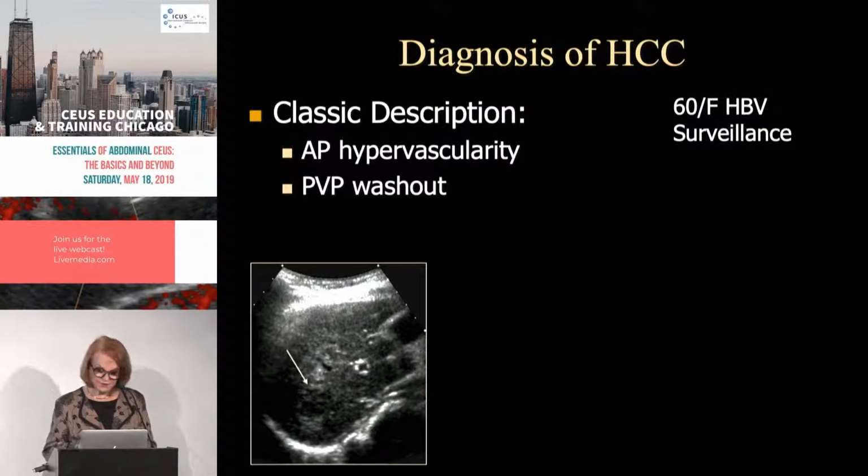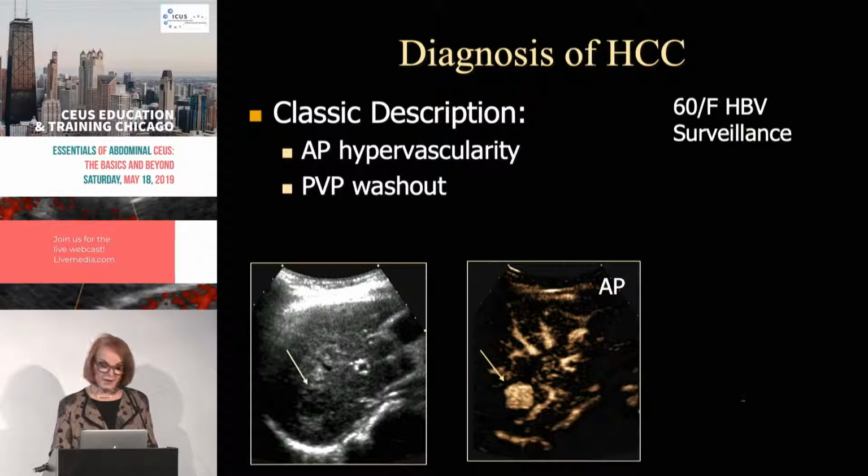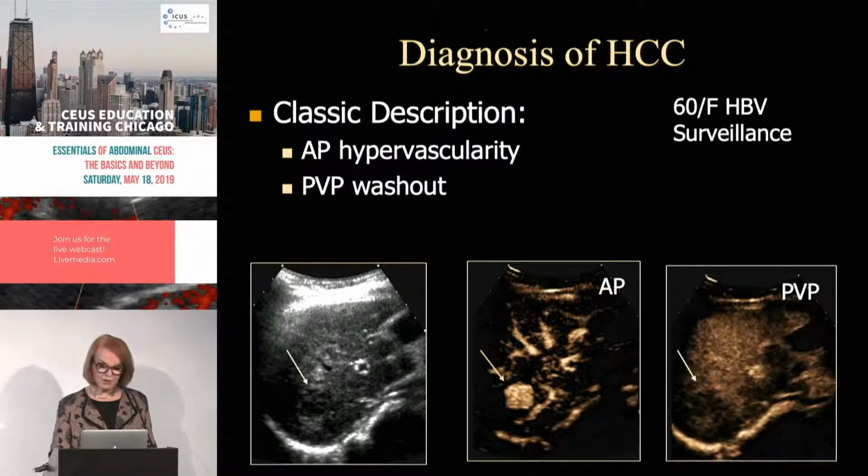Now, this is just a little hepatocellular carcinoma, and I want to just show you this. So there's a grotty little liver with a hypoechoic mass we see nicely. We can see that it's hyperenhancing in the arterial phase, and then we can show that it has washout. So the scan was a great success. And this is a great success on a patient who's had 2 MR scans that were both interpreted as uninterpretable. So this was gross motion artifact.